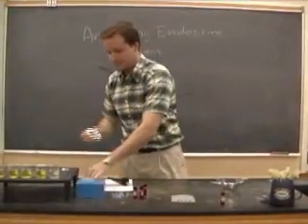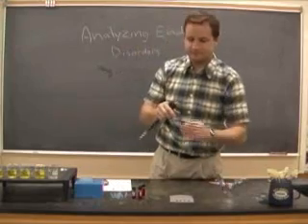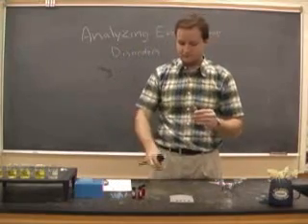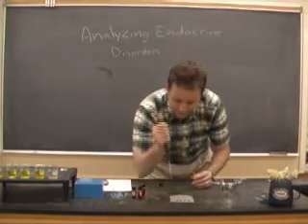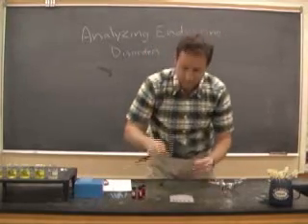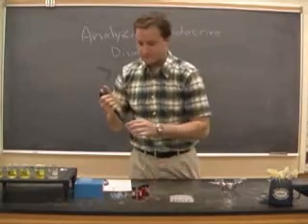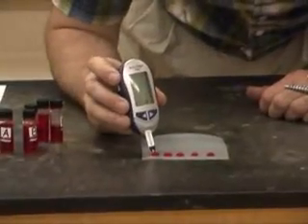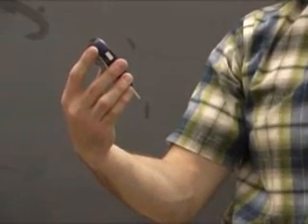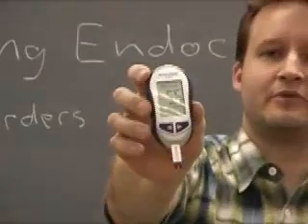And last sample. Sample E. And the results of sample E.